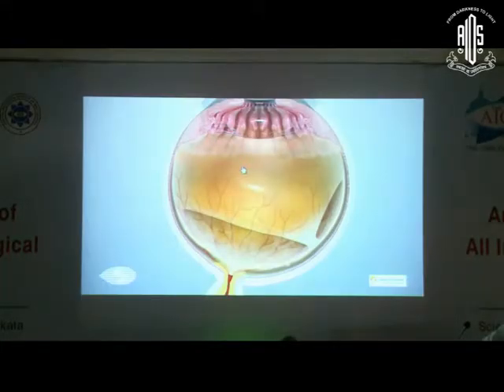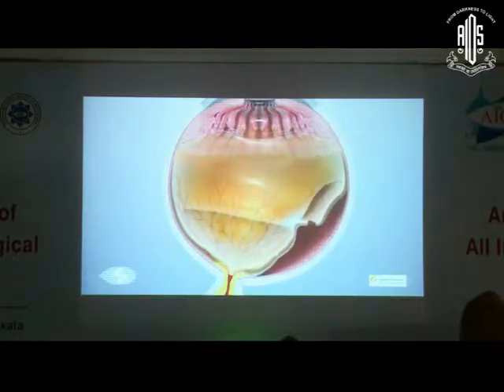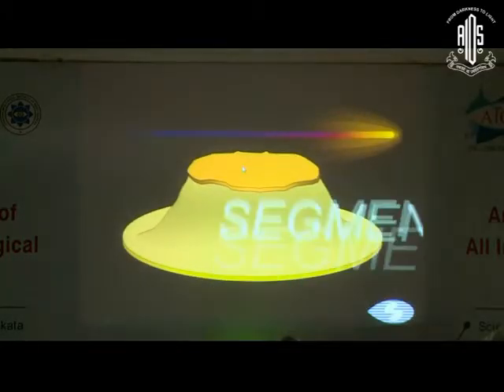And in this situation, this converts, as we saw in the earlier fundus photos, where a tear forms at the base and converts this from a traction into a combined traction rhegmatogenous retinal detachment.